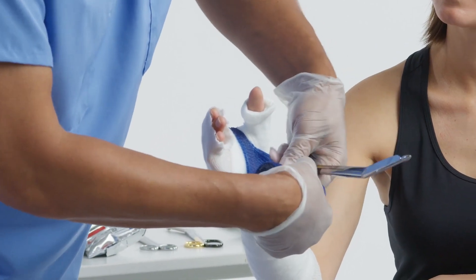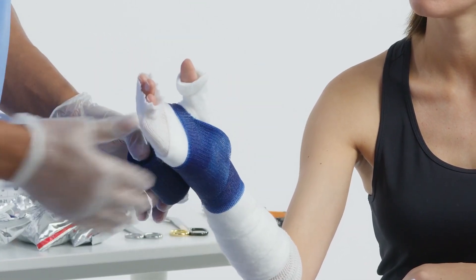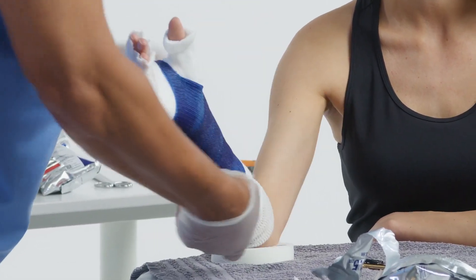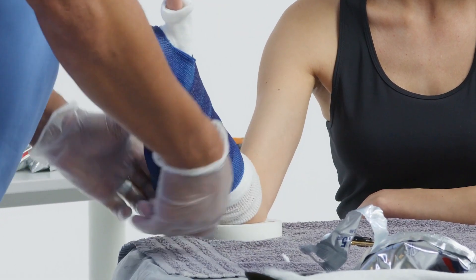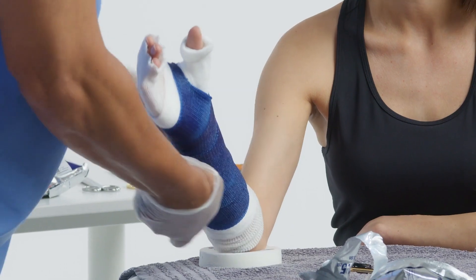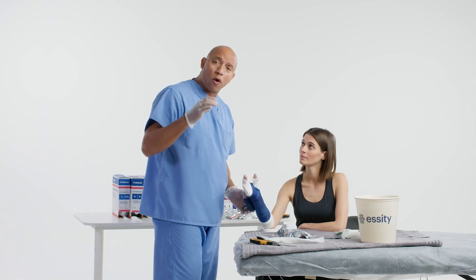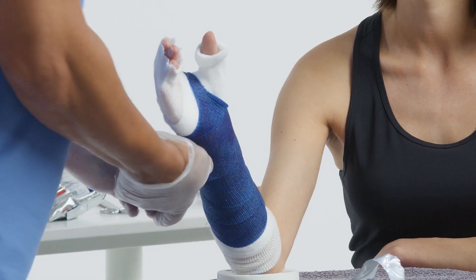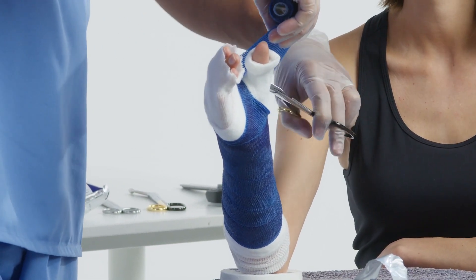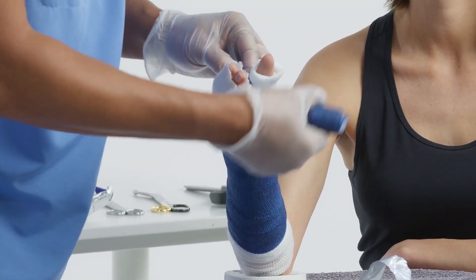I'm not twisting it — I'm just laying the edges and folding them over just a little bit. Now I'll connect that area, doing my 50-50 coverage. I'm using a 3-inch, but you can use a 2-inch if you wish. Sometimes people like to use the wider cast tape to cover more area faster. Another reason some people may want to use 3-inch is that if you need to do a mold, it will stay a little bit easier because it's a little bit thicker.